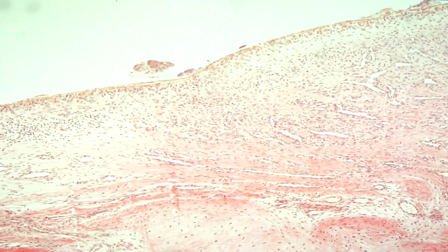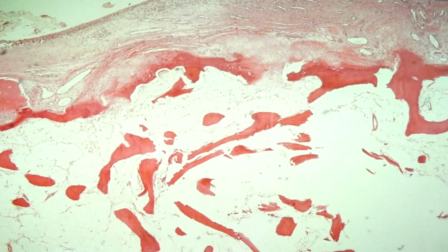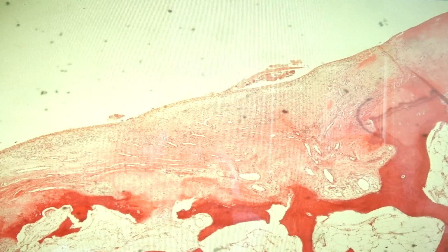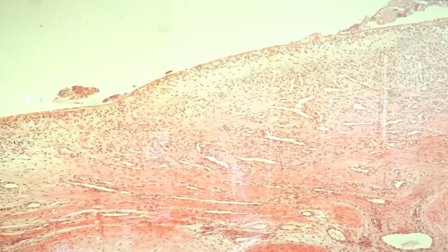Okay, if you're going to look at the slide, let us try to look at the other areas. Okay, so you have bony trabeculae. This portion is the interesting area. Okay, so you can see the surface containing inflammatory cells, and you have granulation tissue, blood vessels, mononuclear cell infiltrates, and then you have fibroblasts.